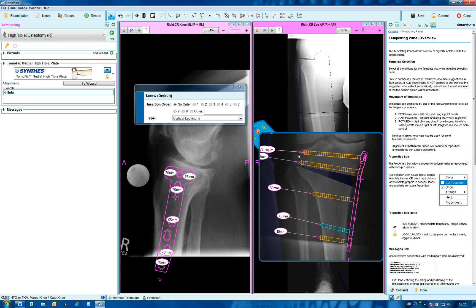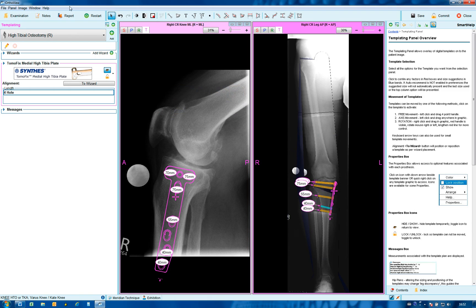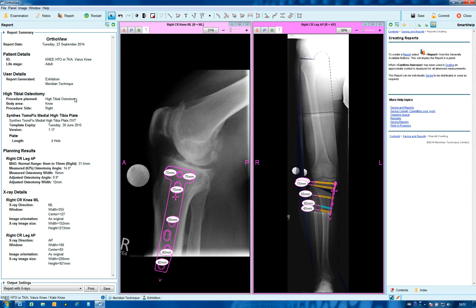When happy with both views, remove the magnifier and view the report. The various measured angles and widths are available, plus template position is shown and screw lengths are also visible. If needed, an AP view of the short knee can also mimic the same cut planned on the long limb with a plate applied. When all images are complete, save or commit to PACS. This completes the video tutorial on varus lower limb high tibial osteotomy.